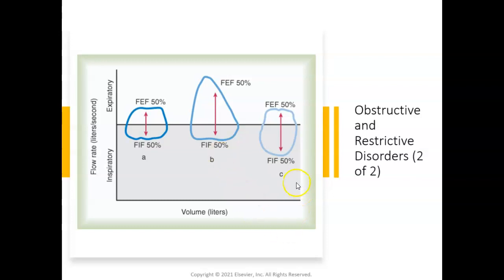So this is, again, another picture from your book. It's just showing your flow volume loops. When looking at interpreting your data, some of these shapes could be altered not just by patient effort, but by the presence of a fixed obstruction. So I mentioned this type of shape could be poor patient effort, or it will be seen with patients who have a solid obstruction in the upper airway.